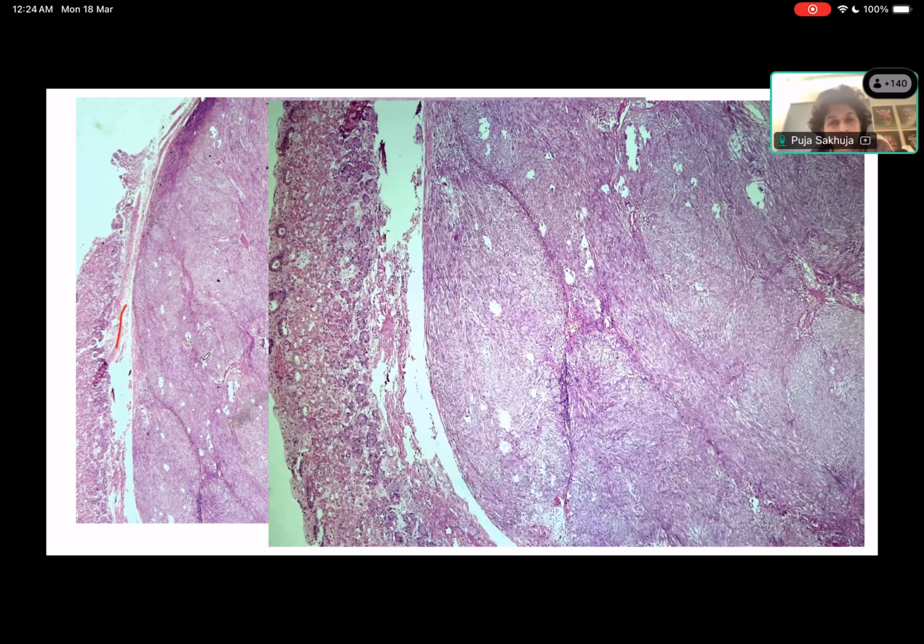Now, one of the important points for gastric GIST, especially when you are looking at them, like for example in this area, is a little bit of clearing, right? What is actually happening in these areas, which is a little more specific to gastric GISTs? Perinuclear haloing. Exactly. And why does this happen? That is an artifact. It is just a processing artifact.